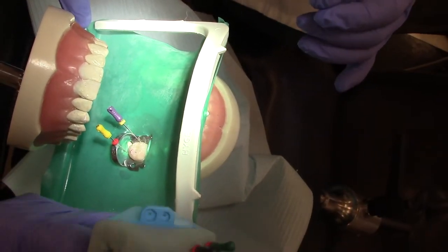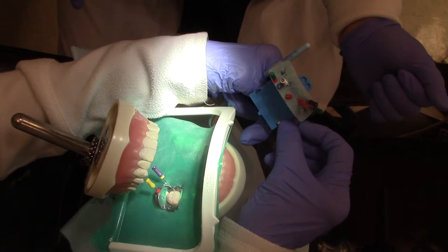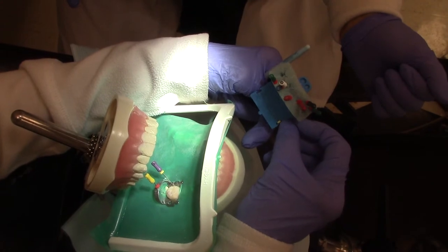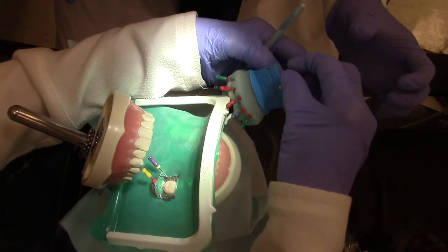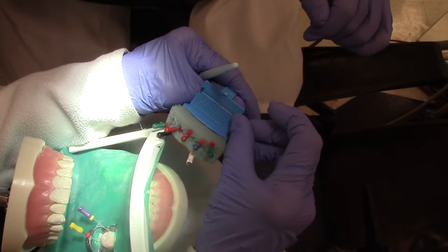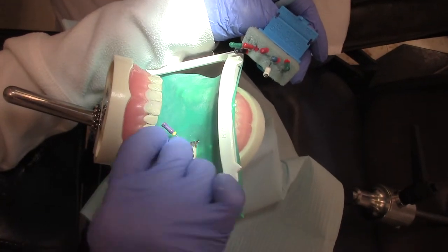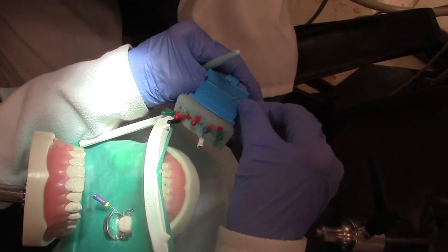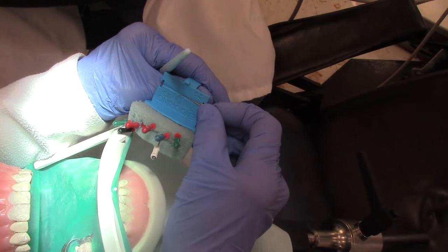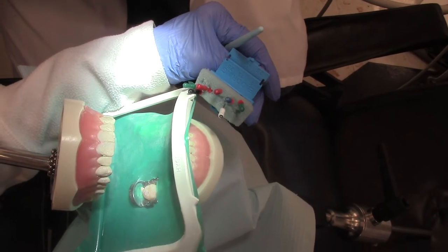At our working lengths we would be using the thumb ruler, which is right here. We would measure: the mesial facial canal is at 20 millimeters — that's how the doctor is going to measure. Our distal facial canal is at 20 millimeters, and our distal lingual canal is at 20 millimeters. So we would file this whole tooth at 20 millimeters.